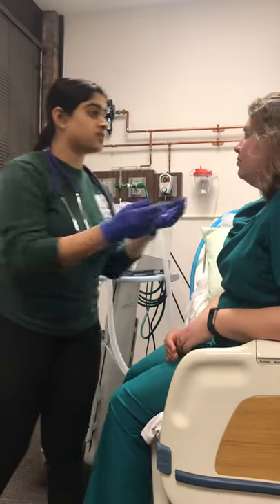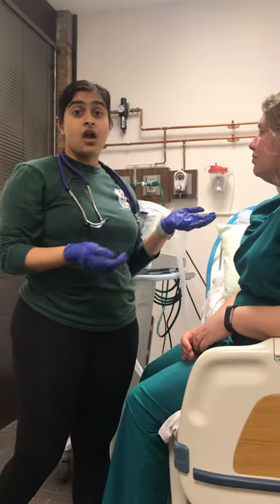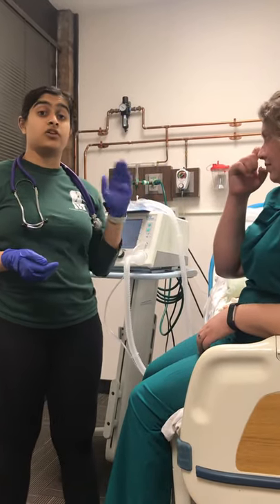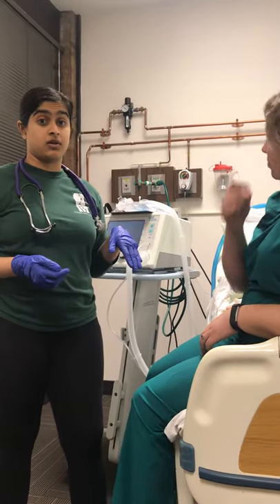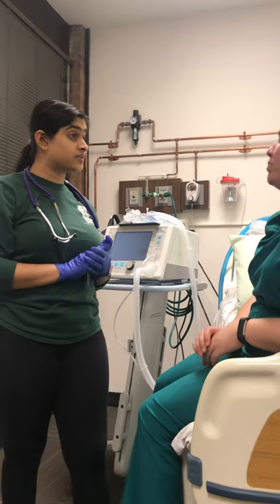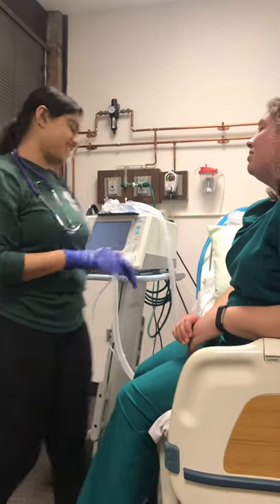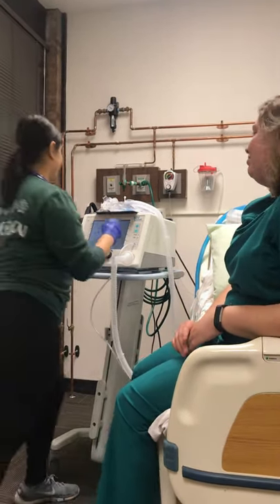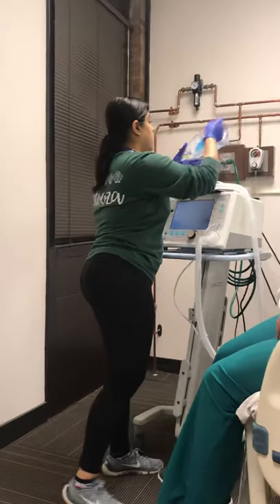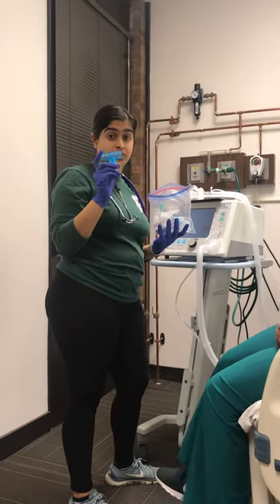I'm just going to assess her face, and I'm not seeing any skin breakdown. I'll also do her vitals and her breath sounds as well. Can I have your name and date of birth? — Megan McCoy, 8/12/98. Thank you. Since we are doing an albuterol treatment, I'll place a T-piece.